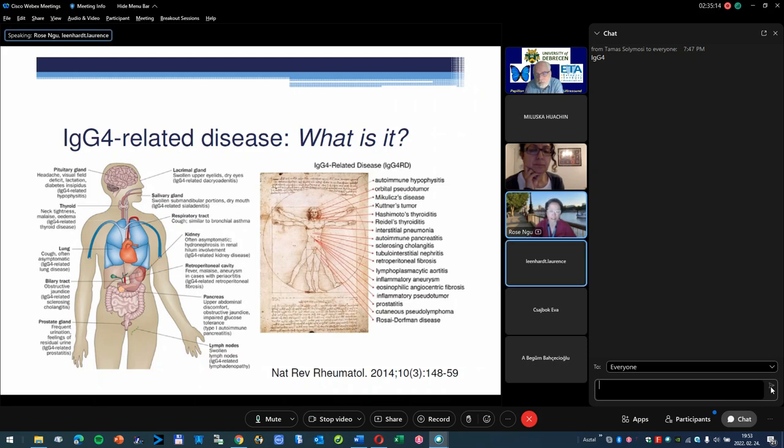As I said, I have very limited experience. We haven't had many. And probably just one of them had it in the thyroid. But again, very vague, very heterogeneous and nothing else. So sometimes when you look at your thyroid and you want to know whether your thyroid is normal and your salivary glands are normal, compare the texture. I sometimes do that all the time. It can be very helpful. Okay. You're very welcome.